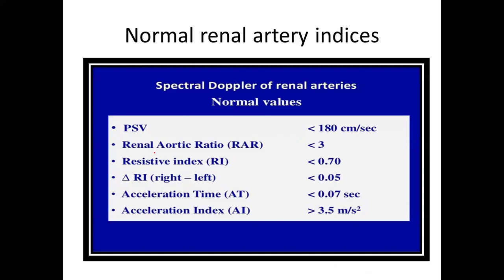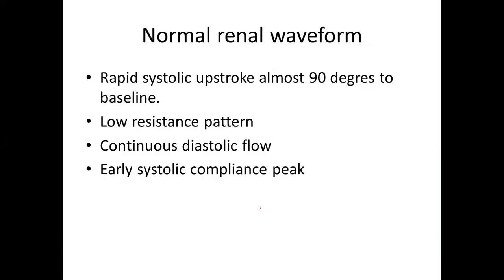Personally, when I started doing these renal Dopplers, I usually had this picture in my phone. It's a very simple picture that you need to refer to before you start memorizing these things. So this one is a very important picture when you're doing renal artery evaluation with ultrasound.